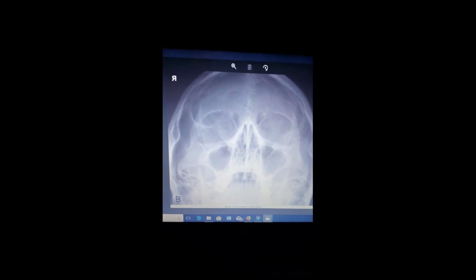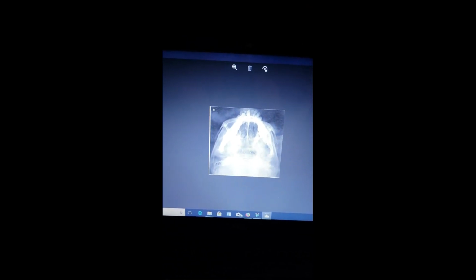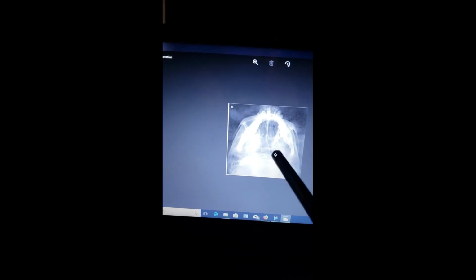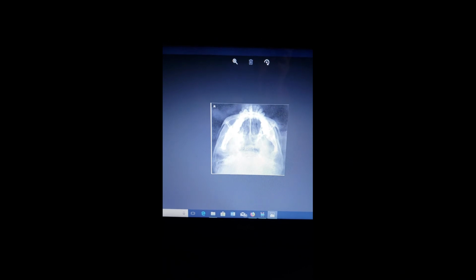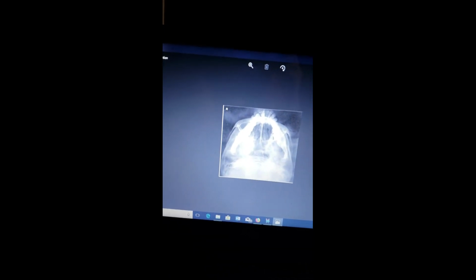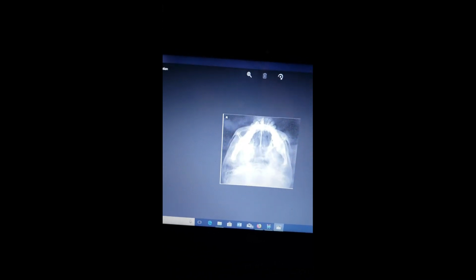For the SMV of the sinuses, there should be equal distance from the lateral border of the skull to the mandibular condyles on each side, indicating that the mid-sagittal plane is perpendicular and there's no tilt. Anterior frontal bone superimposed by the mental protuberance, indicating that the IOML is parallel. The mandibular condyles anterior to the petrous pyramids, and there should be clearly visible air fluid levels if present.